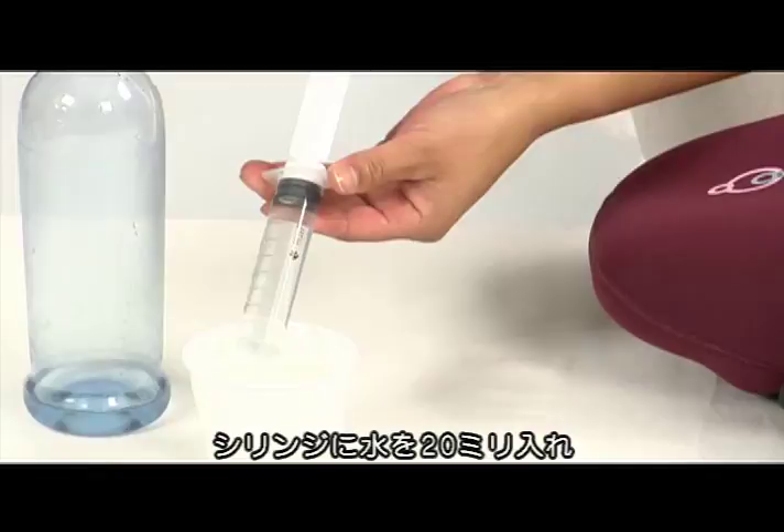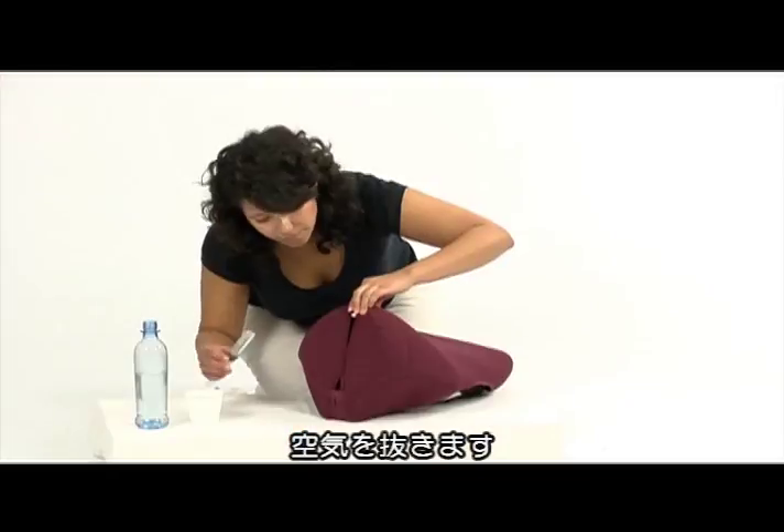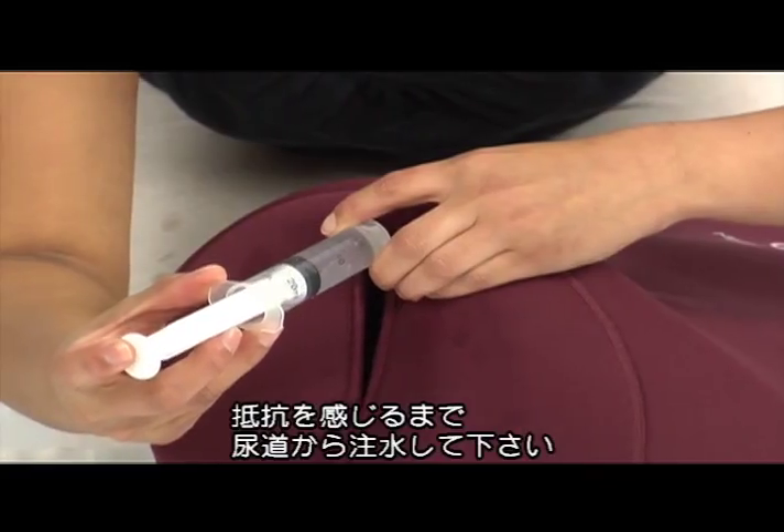Fill the syringe with 20 milliliters of water. Press out the air from the syringe. Inject the water through the urethra until resistance is felt.